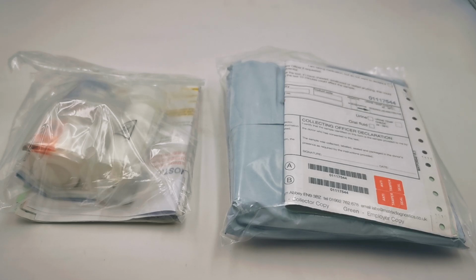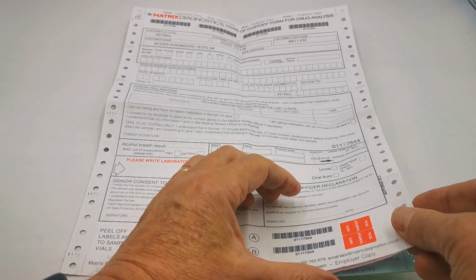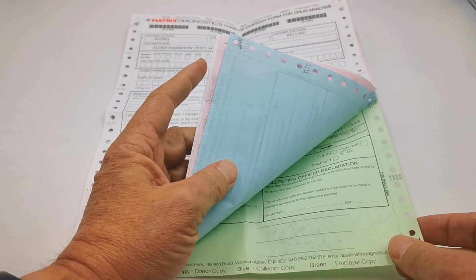So let's open one of these forms and run you through the various elements which have to be completed and show you how to do this. Now, this is the Matrix Diagnostic Chain of Custody form for laboratory drug analysis. It is a 4-layer form. You have a top copy, a pink copy, a blue copy, and a green copy.